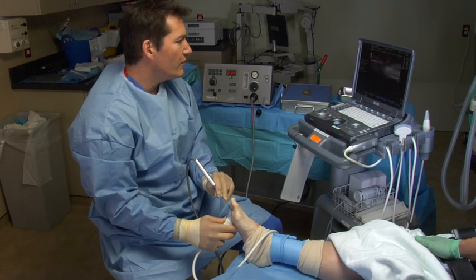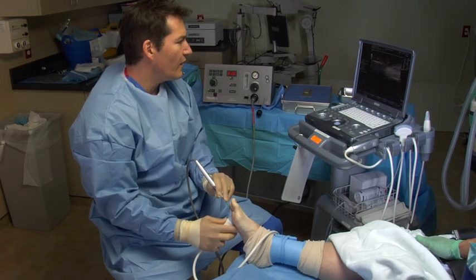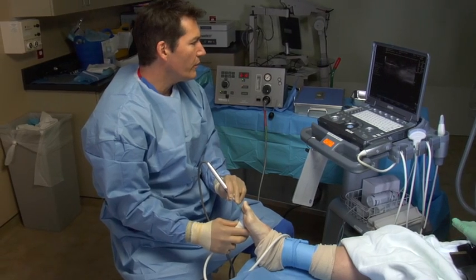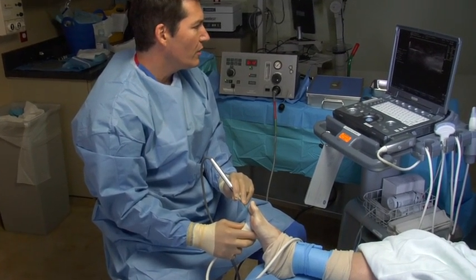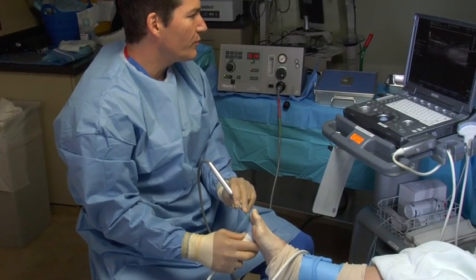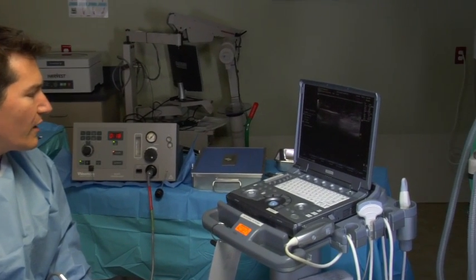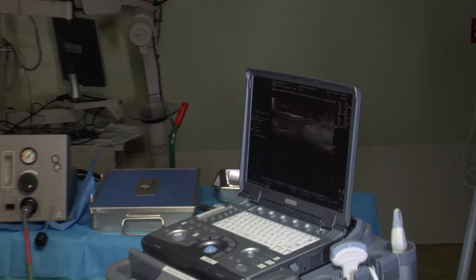When you have a nice ultrasound like this, an $80,000 machine, you're able to see things very clearly. So you can watch, in this case, you can even watch the ice ball form, which is unbelievable. I mean, the technology's come a long way.